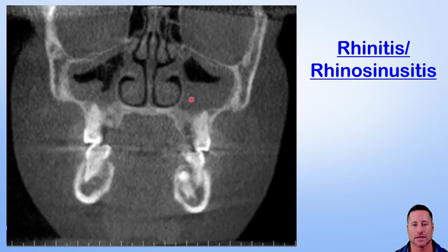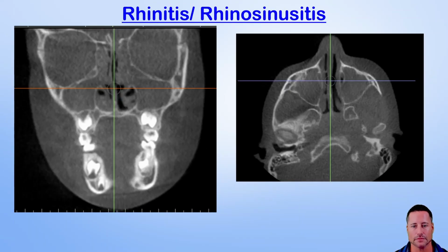And again, there's more fluid in the sinuses, just showing you more. You can see the inflammation in the nasal passageways, just to give you an appreciation for what you're looking at when you see this. And now you're getting into almost a pansinusitis. This is a patient who, again, young kid. This particular case, they had no idea. Because a lot of times these patients say, they're kind of a stuffy kid.